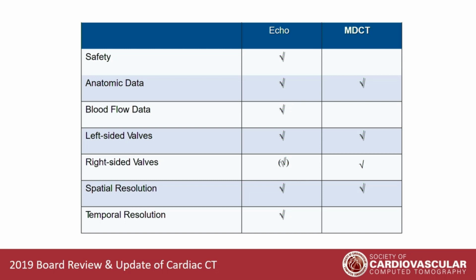With regard to anatomic data, this is kind of a funny thing, right? They both get a check mark on this particular grading system. Anatomic data, if you're talking about the leaflets, it's hard to beat sound waves when it comes to the way that we evaluate the valve leaflets. We do not do as good a job with CT looking at the leaflets themselves.